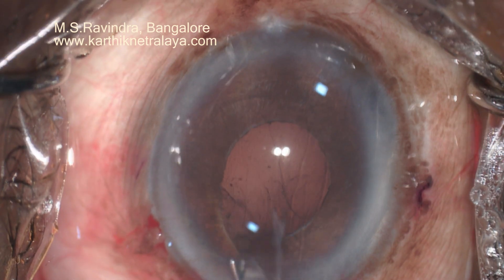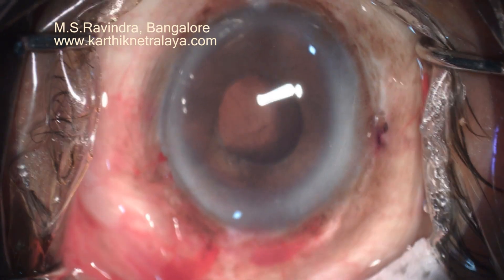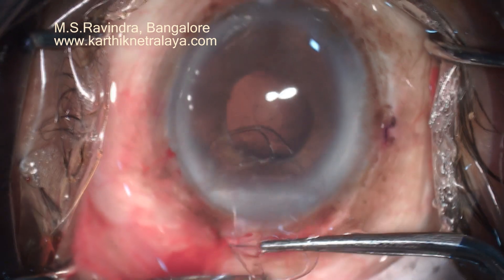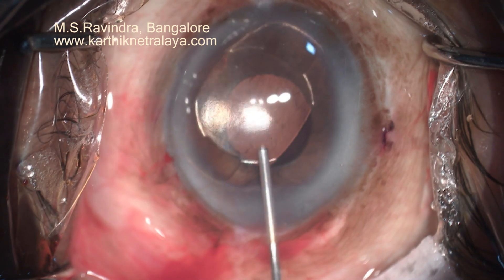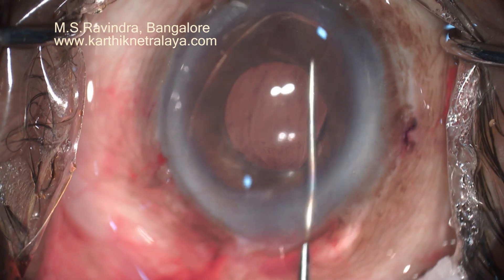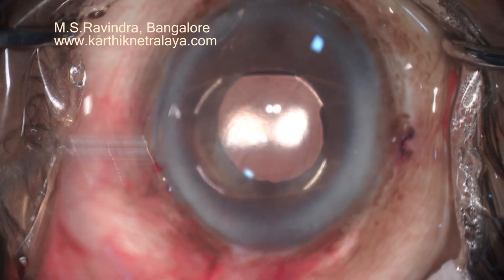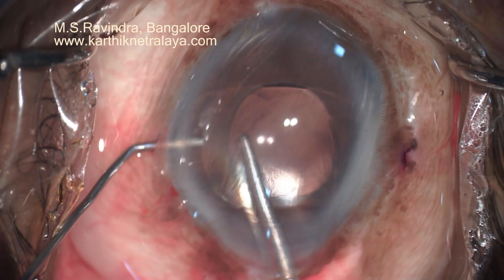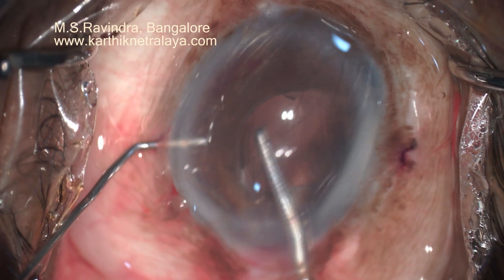An iris claw lens is implanted with its concavity anteriorly so that the optic stands behind the iris and pupil. There is already an iridectomy, so there is no need to do another. The lens is held at the optic-haptic junction and migrated to the retroiris space. With a 27-gauge cannula, it's enclaved two times so that much of the iris tissue is held in between.